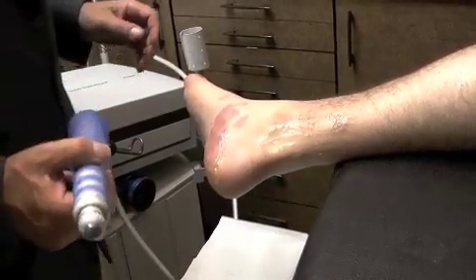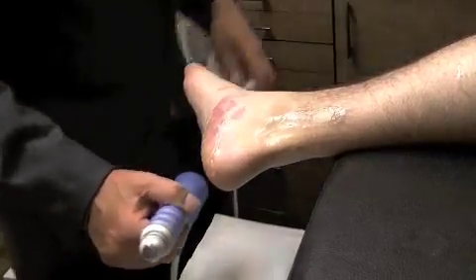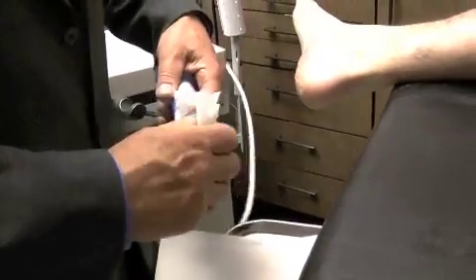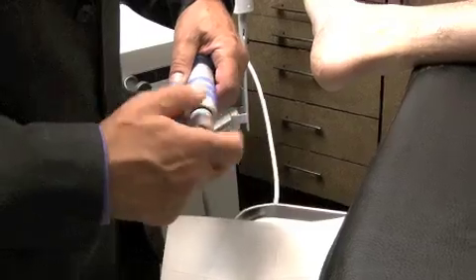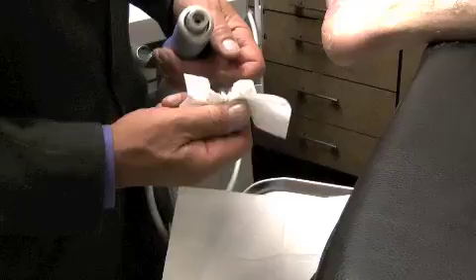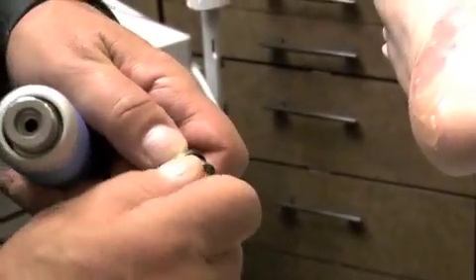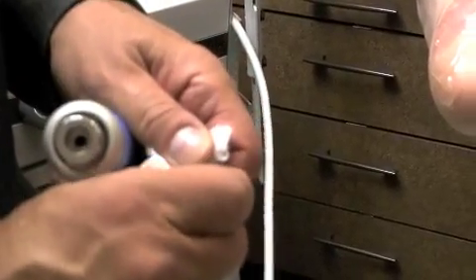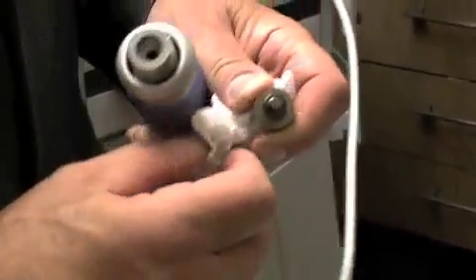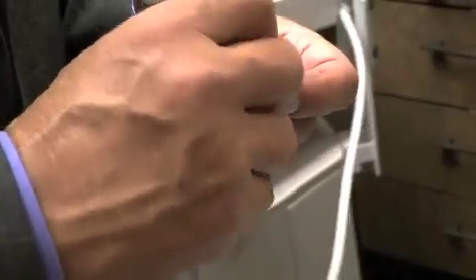I would suggest every so often taking the head off of it, just unscrewing the head here because it gets a little bit of the ultrasound gel on it. And you can just clean this area a little bit. This is the plunger, so you can take out that little plunger and clean it up a little bit. Take the little rubber washers off, and then you can put them back on again, just to make sure it's nice and clean and sharp. The washers have never been broken or anything like that, but if you do lose one of these for some reason, you can always find a store that has these little black washers, but otherwise we just leave them alone. And basically that's the only moving working parts on this machine.